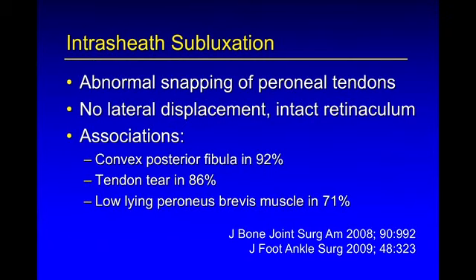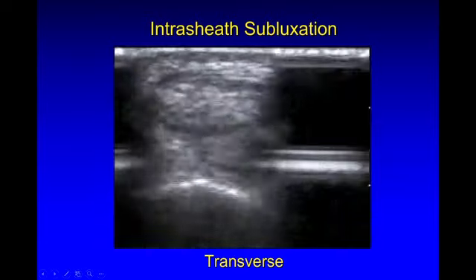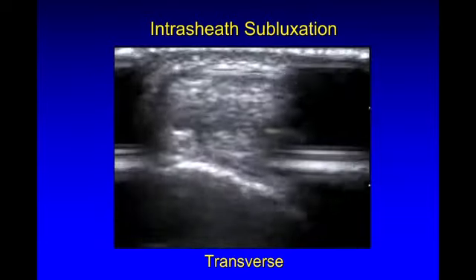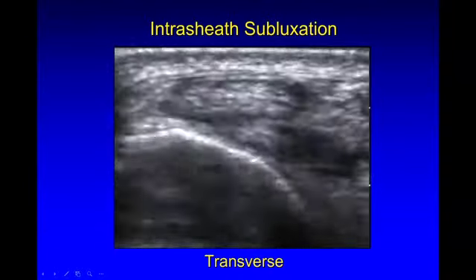This must be differentiated from intrasheath subluxation, where the peroneal tendons may snap on themselves but are not actually displaced because the retinacula is intact. This is a very common occurrence when you have a posterior convex fibula. Normally the fibula should be somewhat concave, keeping these tendons in their location. But with a posterior convex appearance, the tendons are pushed lateral and anterior, and with movement of the ankle we see abrupt snapping of the tendons upon each other. Note the thin retinacula is normal here as it's attached to the fibula.